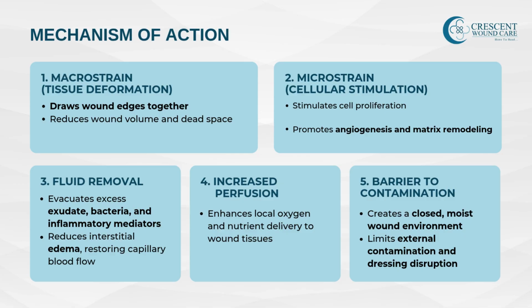decreased edema, improving oxygen and nutrient delivery to the wound bed, stimulation of angiogenesis, promoting the growth of new capillaries, maintenance of a moist and sealed environment, which supports cell viability and protects against external contamination. This combination of mechanical and biological benefits makes NPWT a powerful tool in wound management.